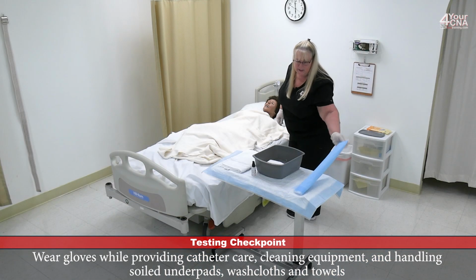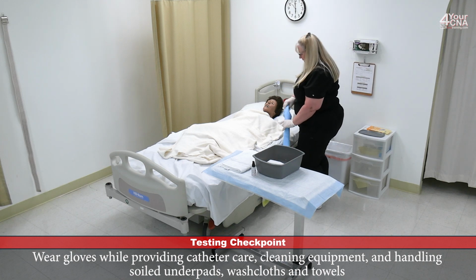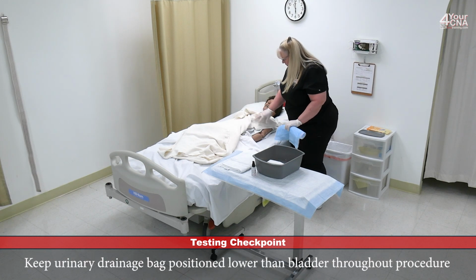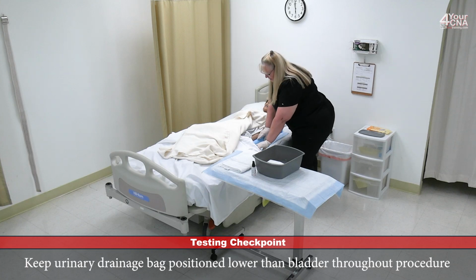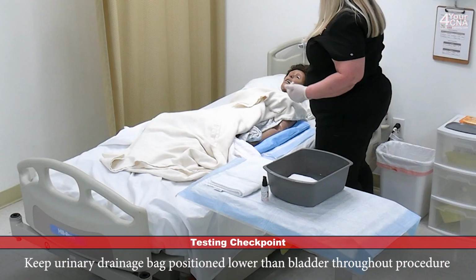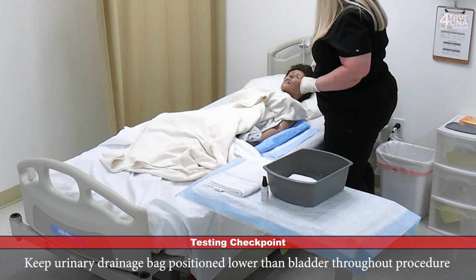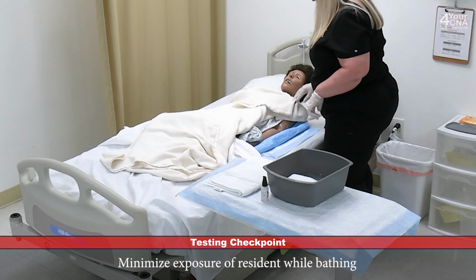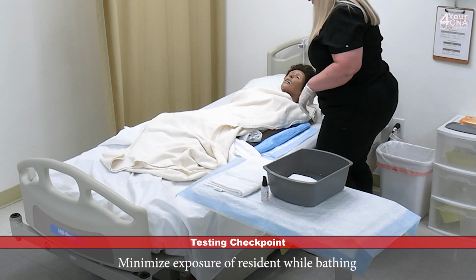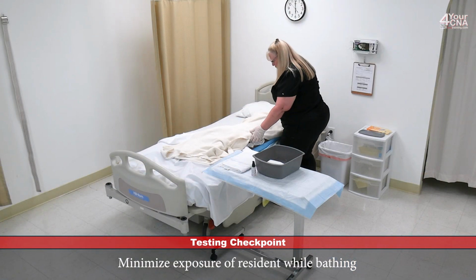Okay, Miss Jones, we're going to place the underpad under you to keep your sheets dry while we do this skill. So I'm going to place an underpad on the bed. And in just a moment, I'm going to ask you to scoot toward me. I'm going to roll you on your side, and then we'll spread that underpad out. So on the count of 3, go ahead and scoot toward me. 1, 2, 3. Thank you. And now I'm going to roll you on your side.